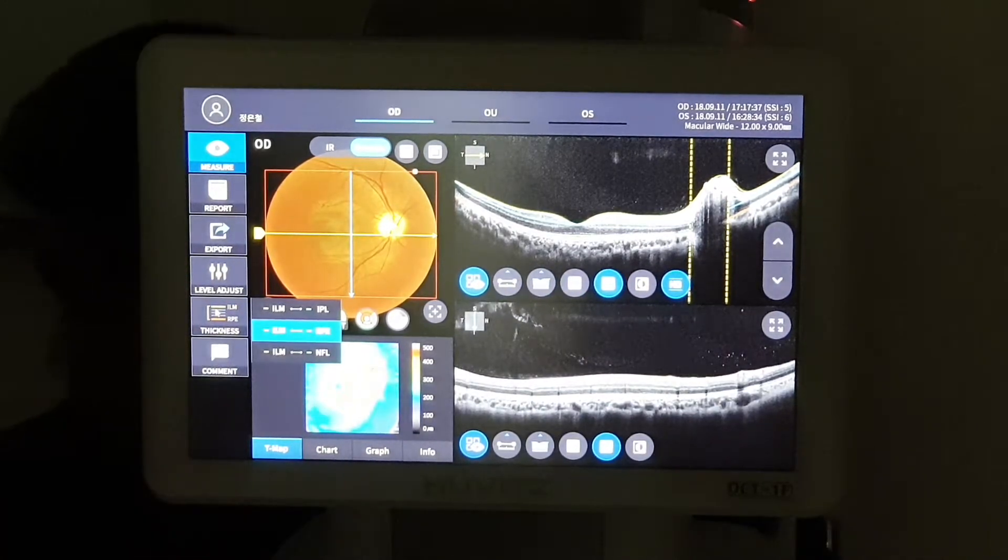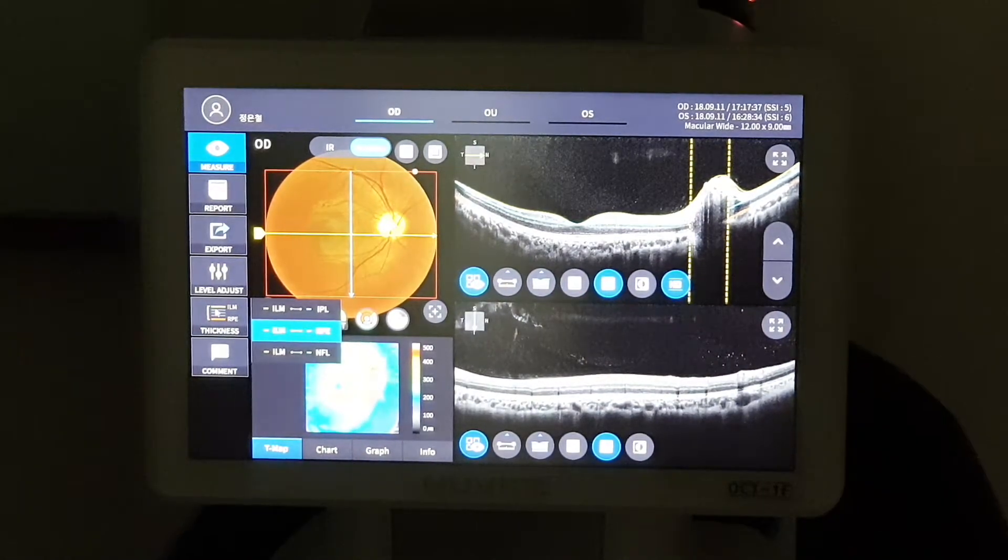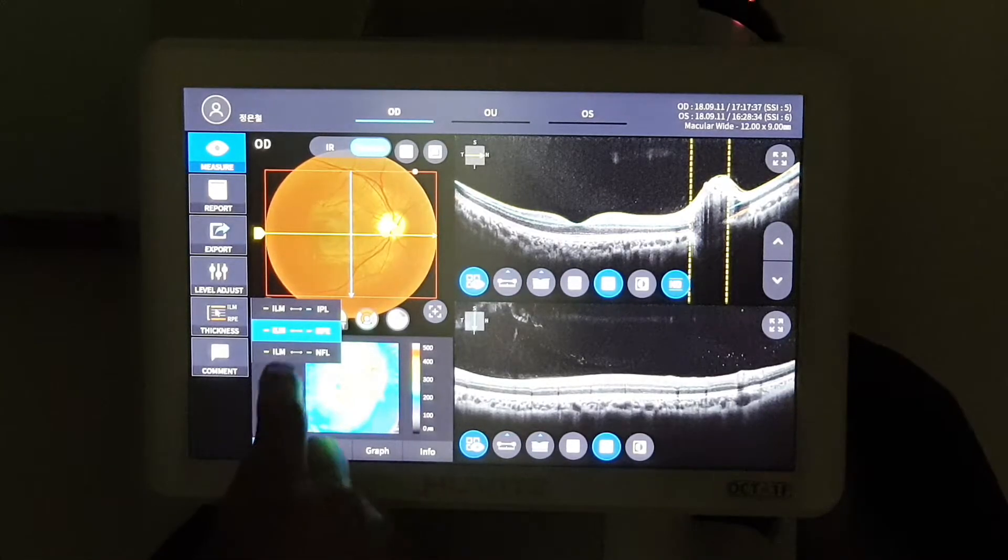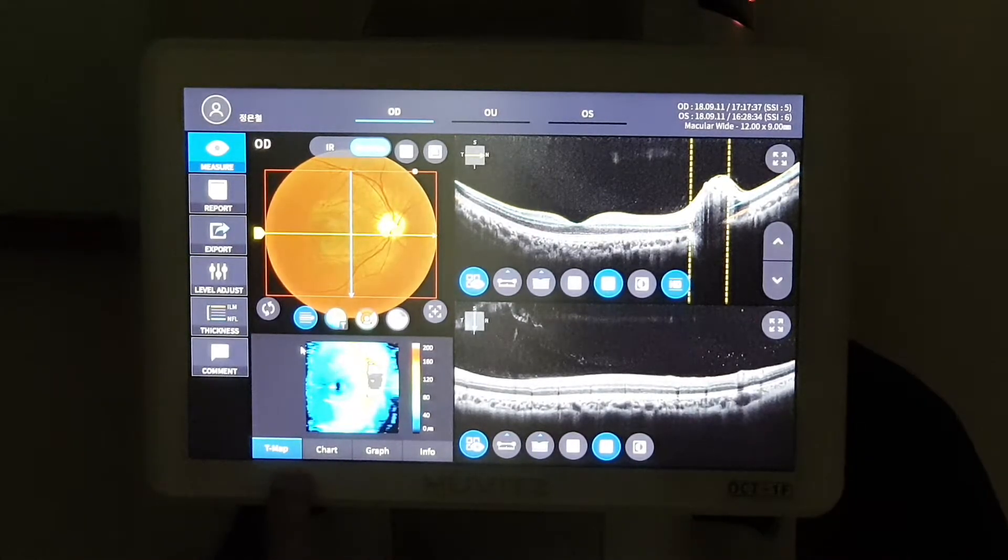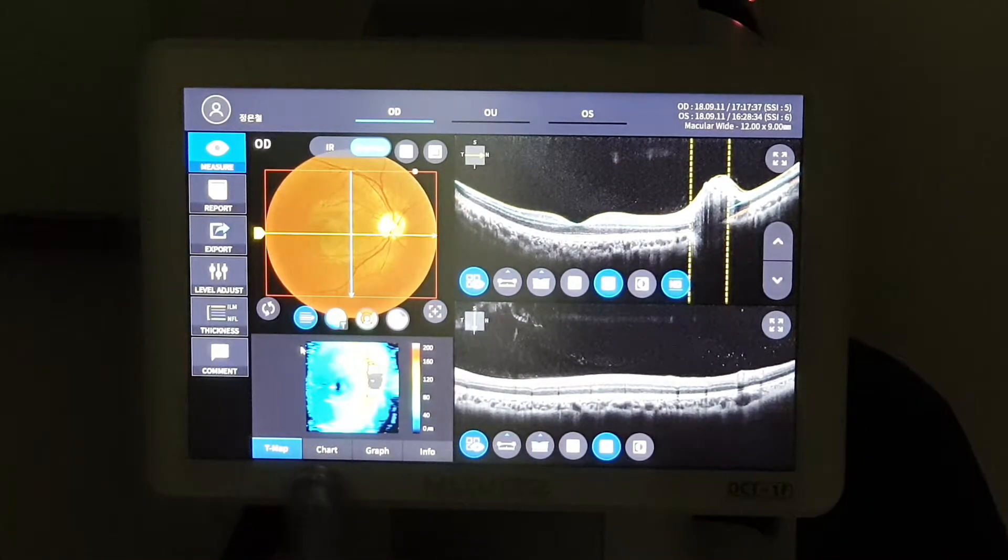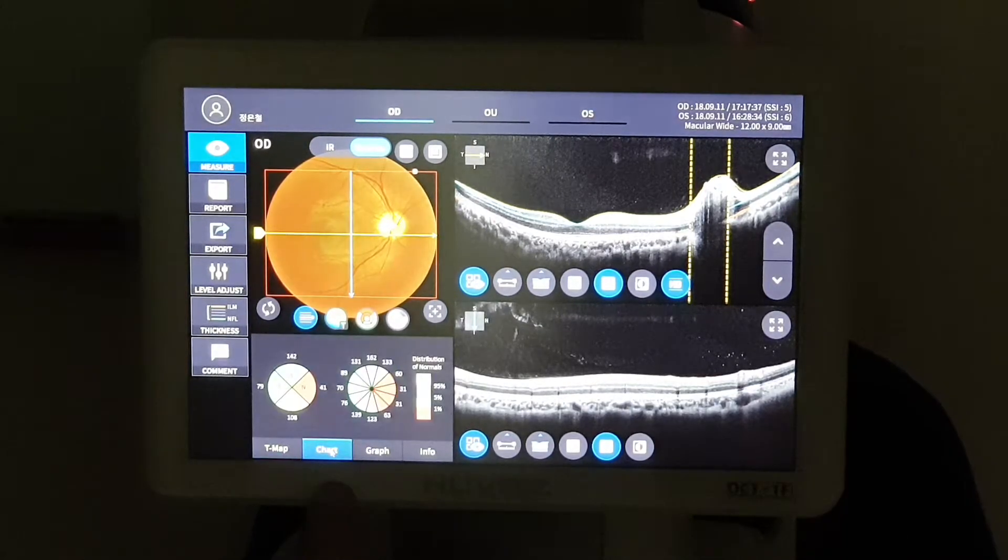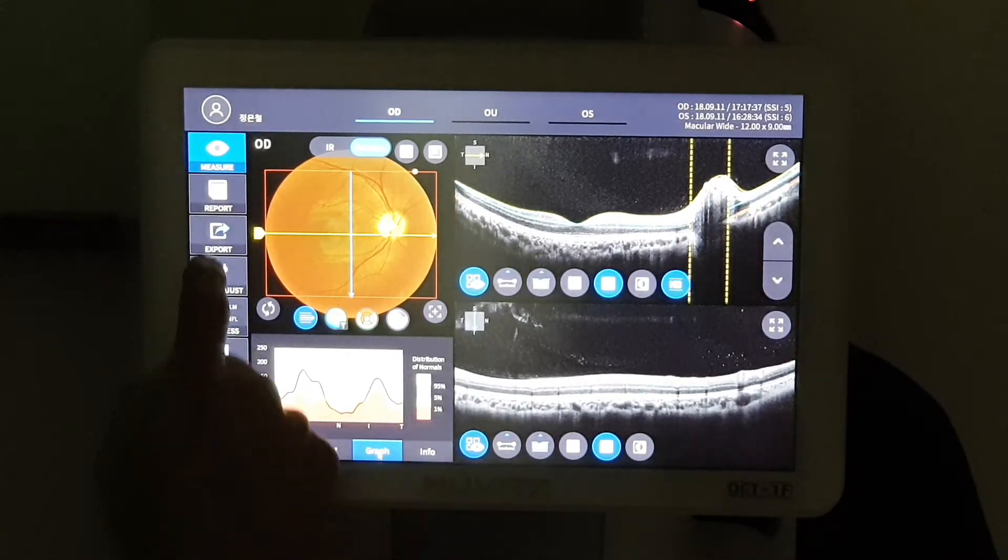In the left side of the screen, there are three kinds of thickness range and we can check the three kinds of things such as t-map, chart, and graph at one time.